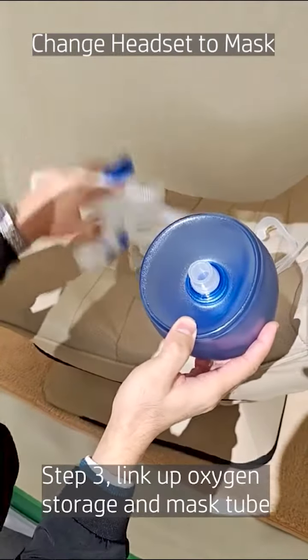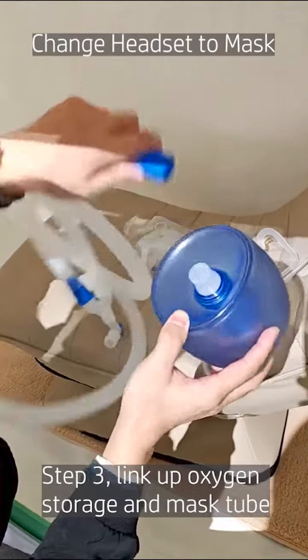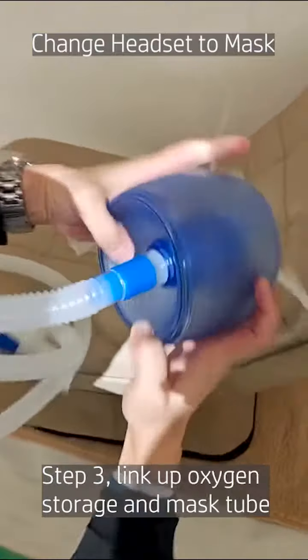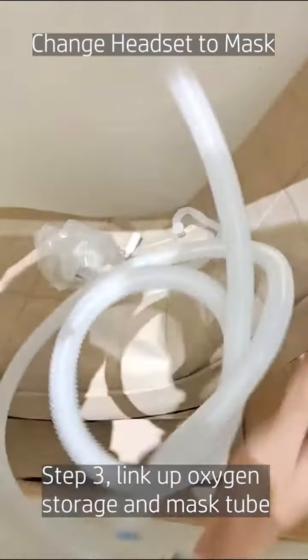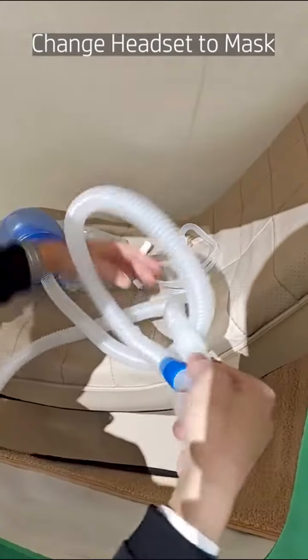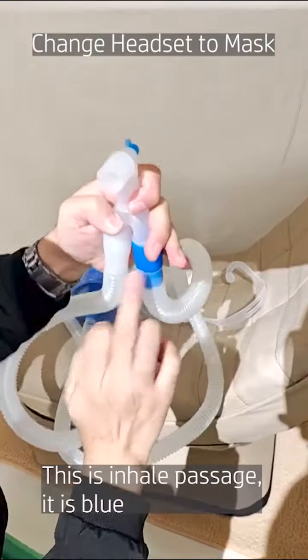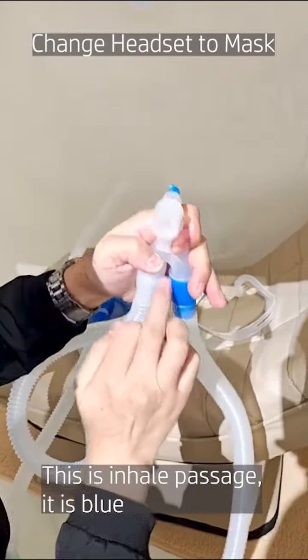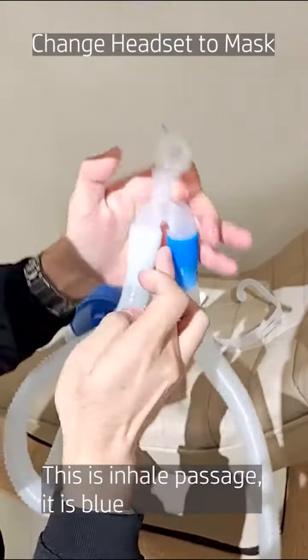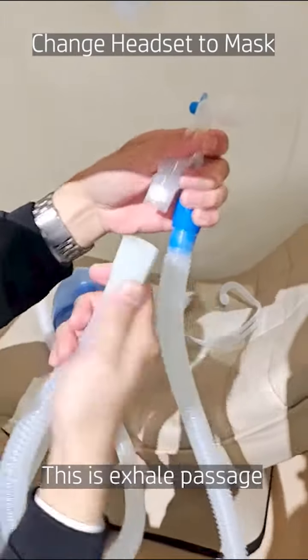Step 3. Link up oxygen storage and mask tube. This is the inhale passage. It is blue. This is the exhale passage.